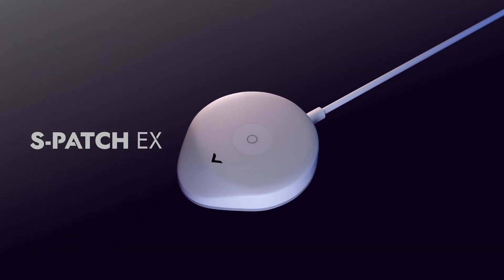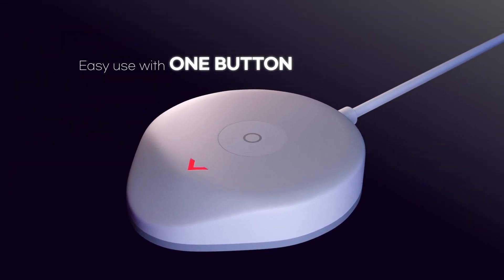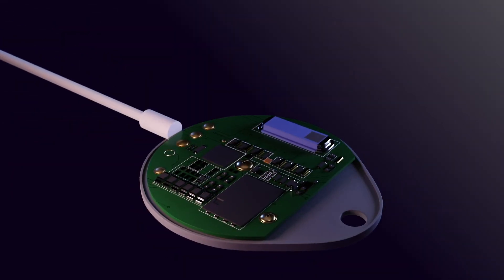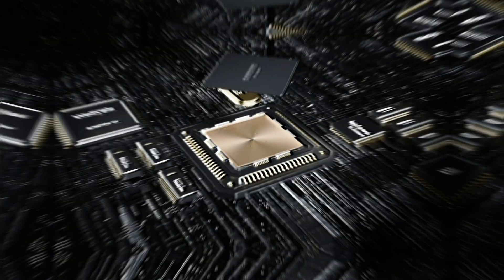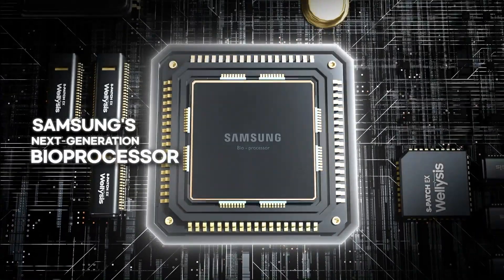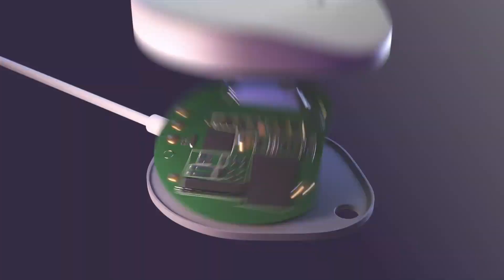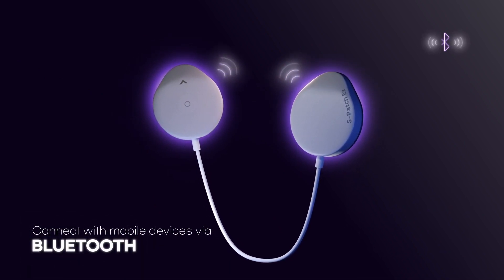Introducing the more powerful Aspatch EX. With only one button and without missing any data, Aspatch captures a range of biometric signals including electrocardiogram, and quickly transfers the data to connected devices.